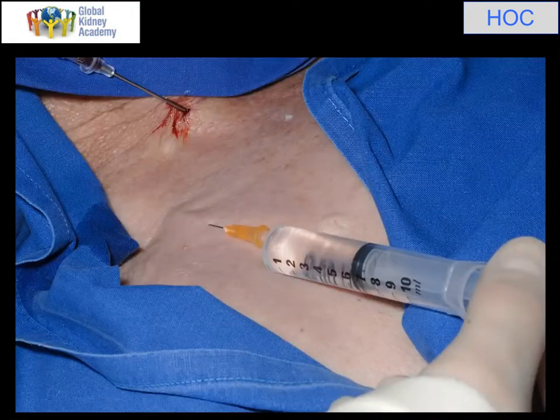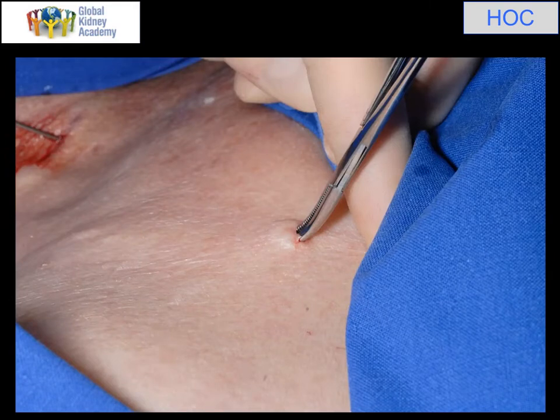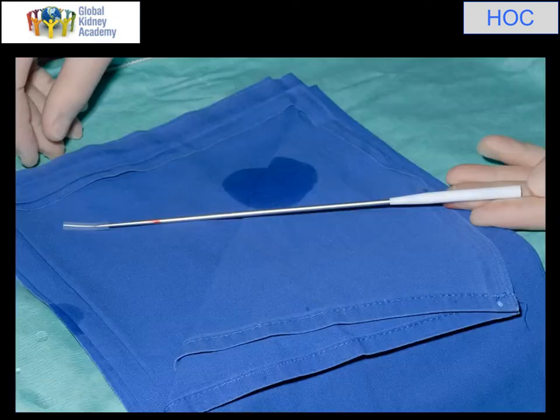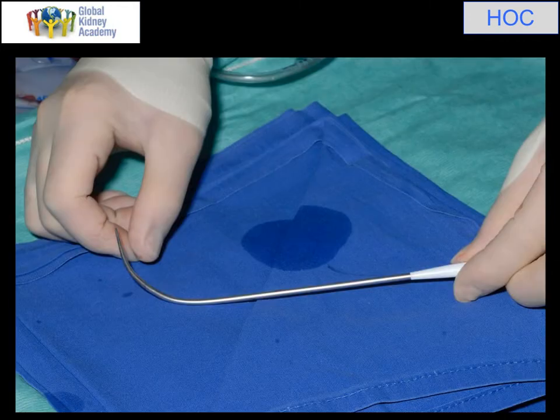I'm anaesthetising the exit site using an orange needle and I always run the first bit of the tunnel completely vertical — I don't head in this direction, I head up and then round. I've put a scalpel in and now I'm just slightly opening up the exit site and the first bit of the tunnel. I've equally incised the neck and opened up the tissues slightly. The tunneling rod in these packs is completely straight; in other packs you see the rod with a slight bend on the end. I can tell you after thousands of these lines, the way I'm going to show you for bending a tunneling rod is the best way.